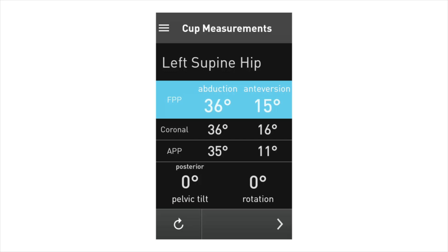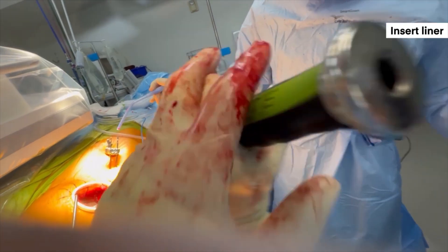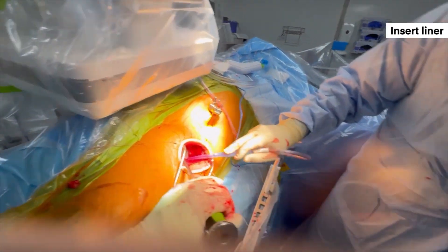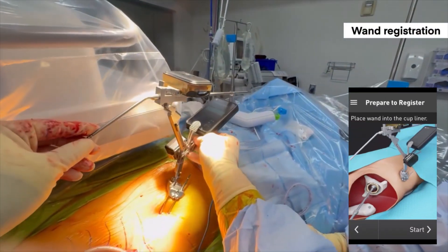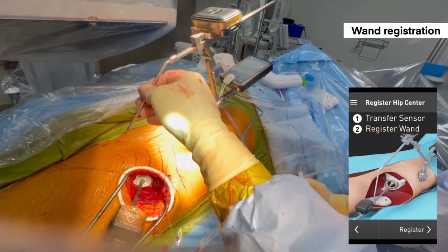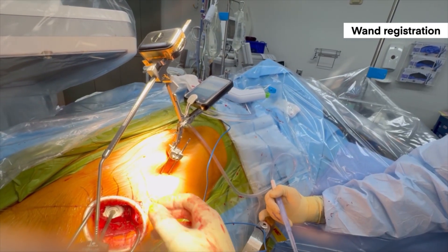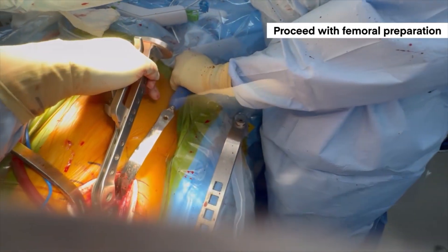This patient was positioned relatively neutral at zero degrees of pelvic tilt and zero degrees of rotation. To give the system accurate information regarding final leg length and offset, we use the wand registration step to register the pivot point of the acetabular component, to be later used to restore leg length and offset. At this step, you use the appropriate femoral head size. There is a magnetic divot that the probe sits into and adheres nicely, and we use the sensor on the wand registration tool and hit register. The Lantern system then comes off and you proceed with femoral exposure and broaching as normal.